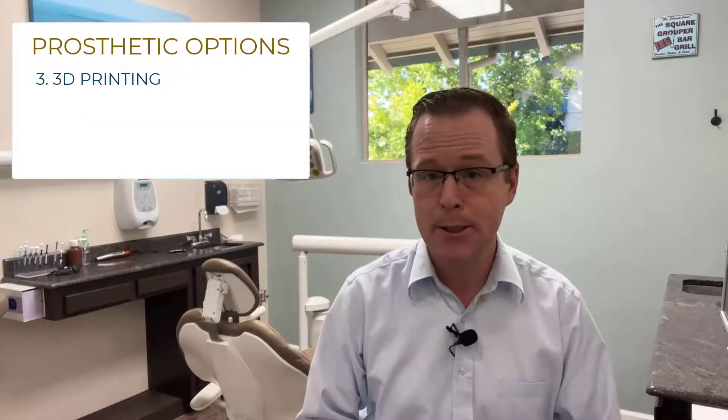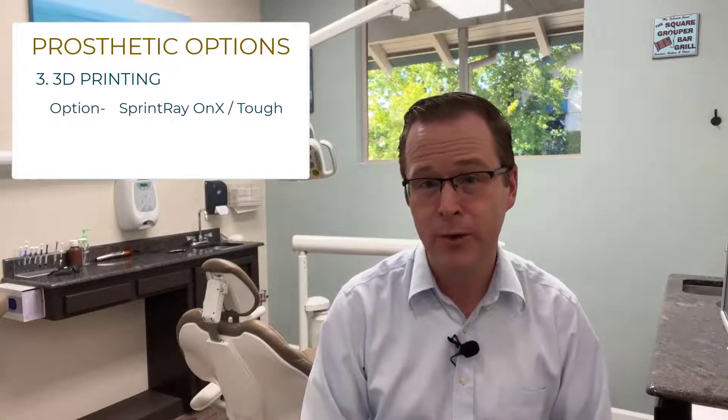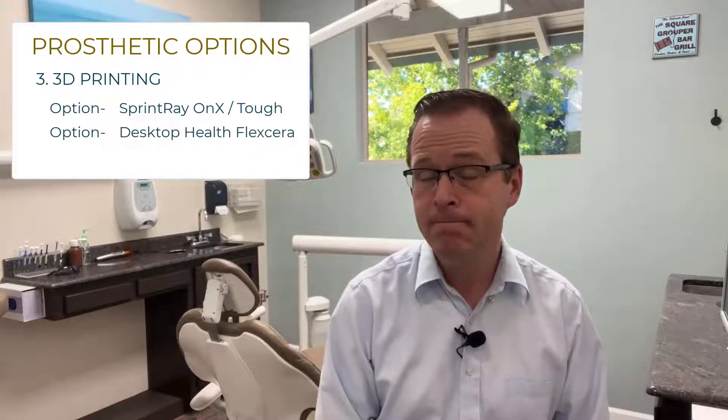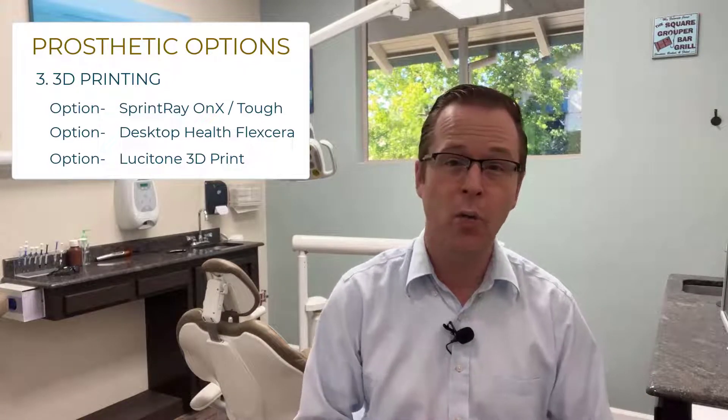You can also utilize 3D printing technology for your Locator Fixed case. 3D printing technology could come from a variety of different materials, printers, and resins — such as SprintRay's OnX or OnX Tough material, Desktop Health Flexcera material, and certainly Lucitone products from any printer such as a Carbon printer, an Asiga printer, or the Lucitone 199 and Lucitone Digital Prints ecosystem.